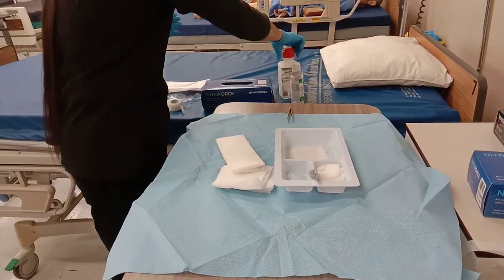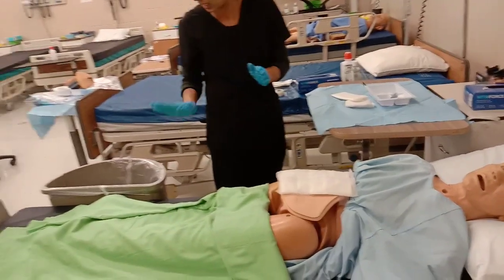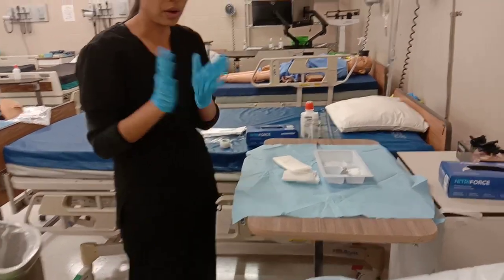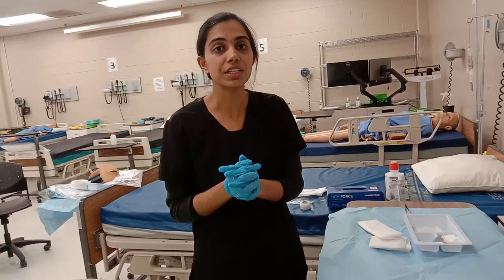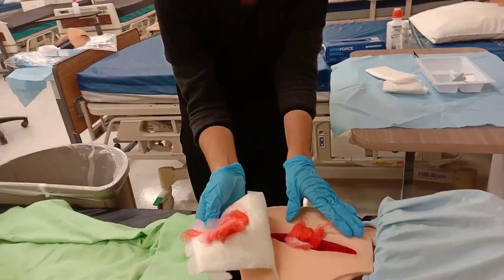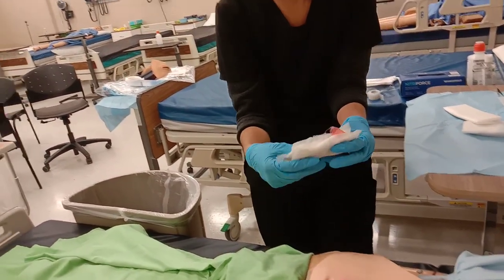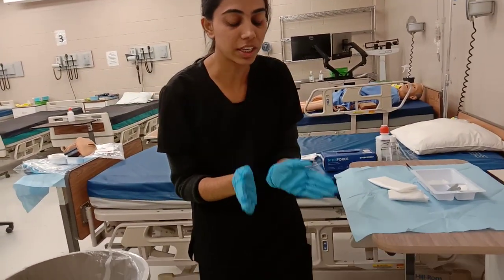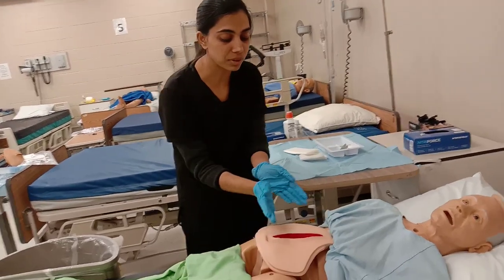So as you can see, I have maintained my sterile triangle. This is tray, this is my patient, and this is my garbage. So now I do not need to change my gloves as my gloves are clean, and I'm going to inspect my wound. I'm opening the dressing. So as you can see, there is mild serosanguinous discharge in there, which is from the wound. I'm going to inspect the wound. The location of the wound is at the abdomen, at the midline, just above the umbilicus.